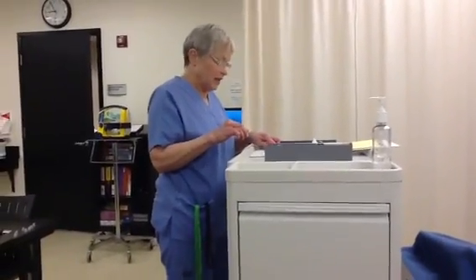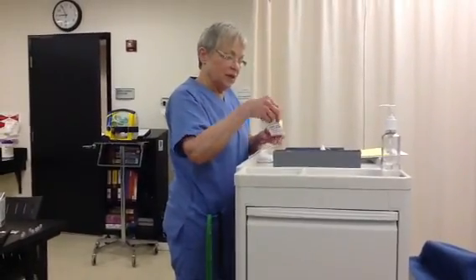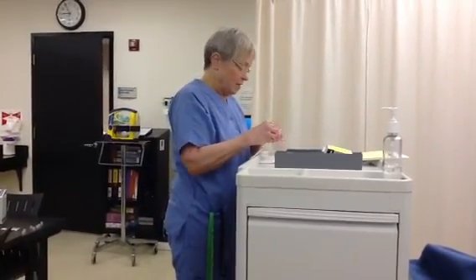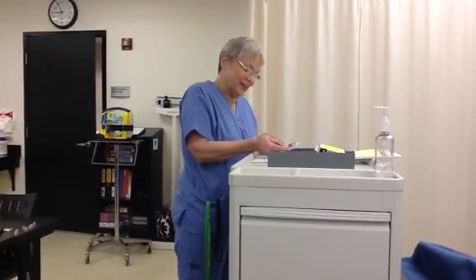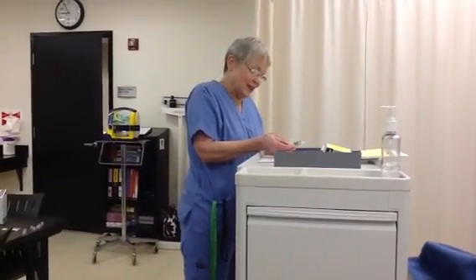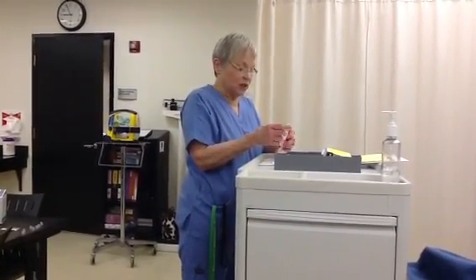I come down again systematically to Aero Inhaler, which is my next medication, and I have demo dose Aero Inhaler, 1 inhalation, twice daily at 8 a.m. for Florence Nightingale, and the expiration date is 2020.